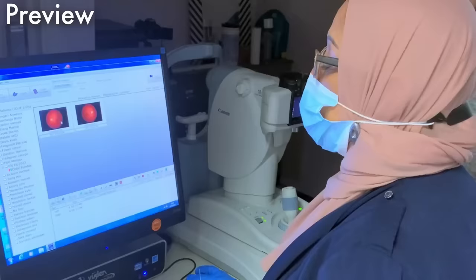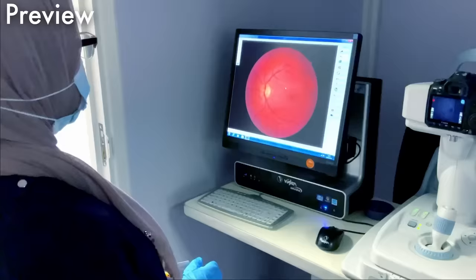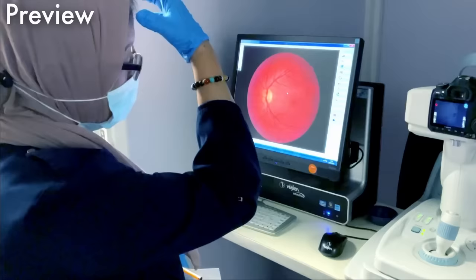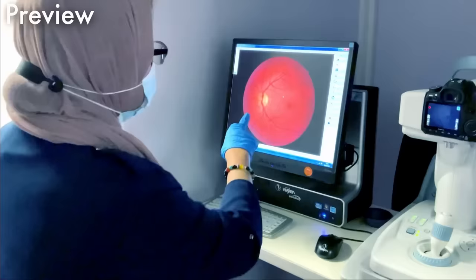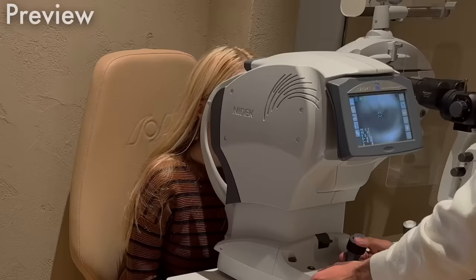So these are your blood vessels that come in from our brain. There's a whole pool of blood vessels that come in the brain, and that's called the circle of Willis, and then all those vessels come into the eye, into your optic nerve, through your optic nerve, and onto the retina. So this is your optic nerve, the sort of pale part, which is the nerve that travels to the back of your brain. See an image of a hot air balloon? Yeah. Let's keep looking at that.